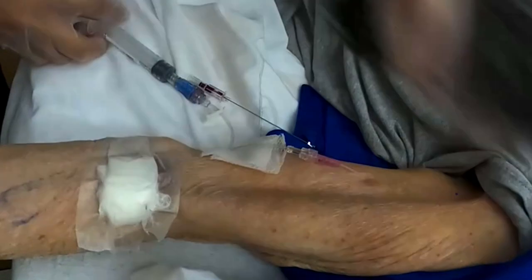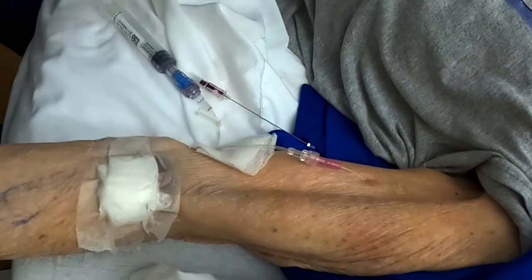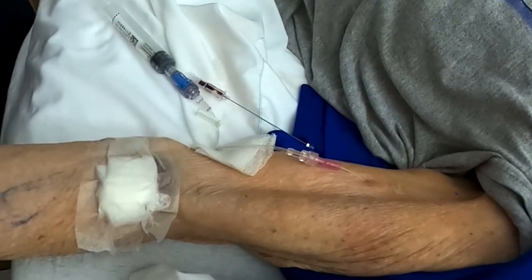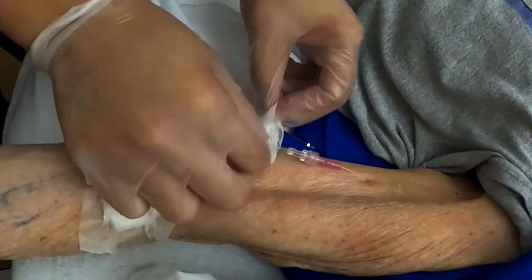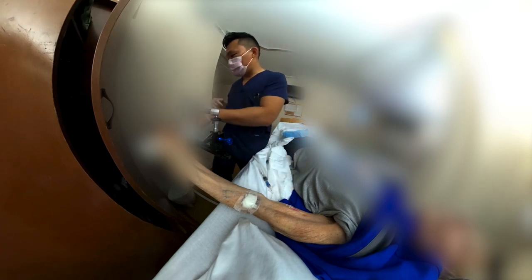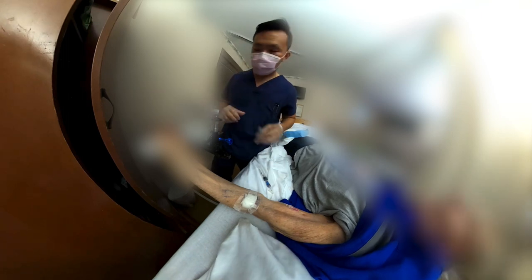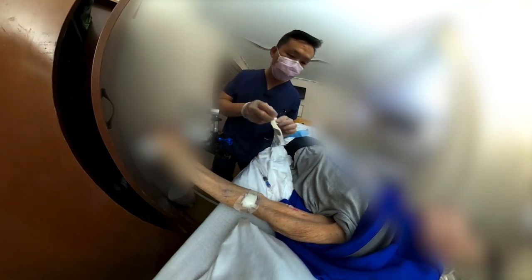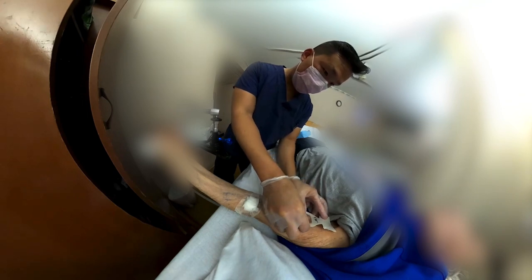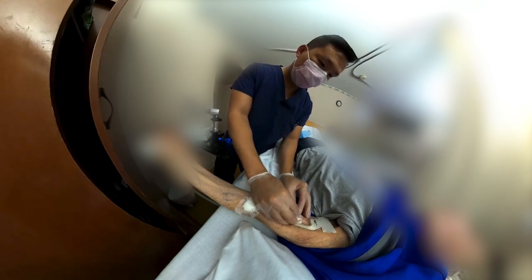I know it's out way more than I'd like, and this does have a higher risk of pulling out, infiltrating. But luckily he only needs 1 liter of fluid, which is gonna finish before any of that movement is gonna affect him. We're gonna keep it there, and rather than sticking him because it's already working, we're gonna hope for the best. Now, what I probably should have done, or would like to do better next time, is more threading. I should have threaded more of the needle in, and I shouldn't have been so confident, but you know, hindsight's 20/20. This is another good reason why you want to thread the entire needle during the insertion process so you don't come across this kind of problem.